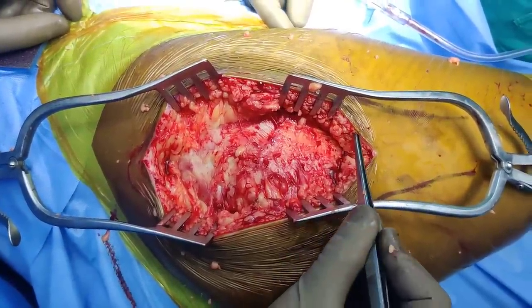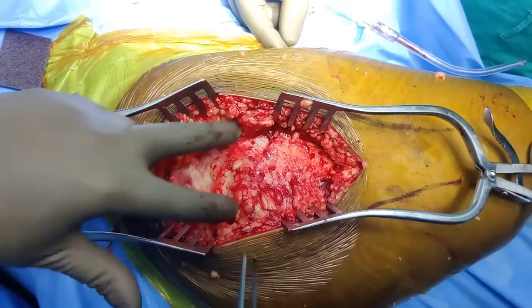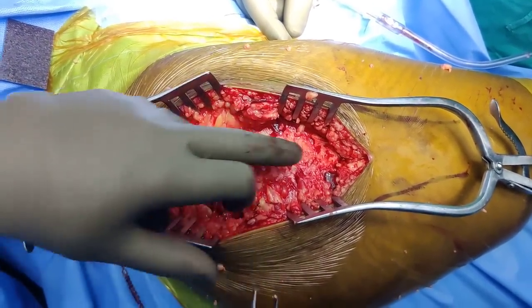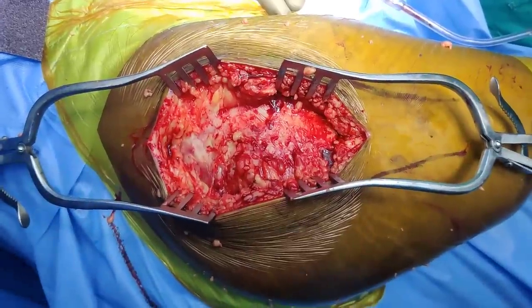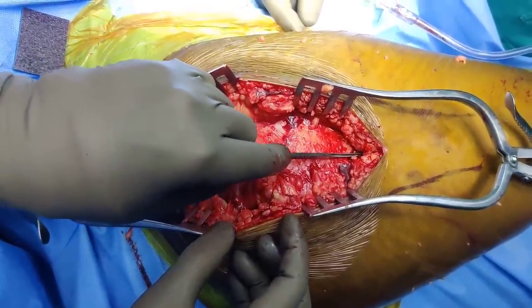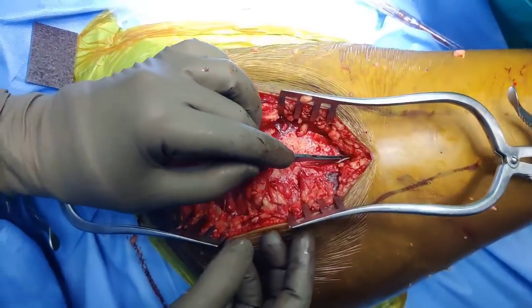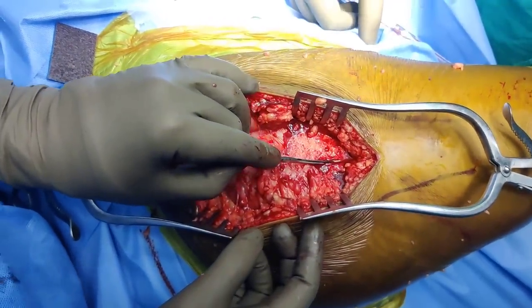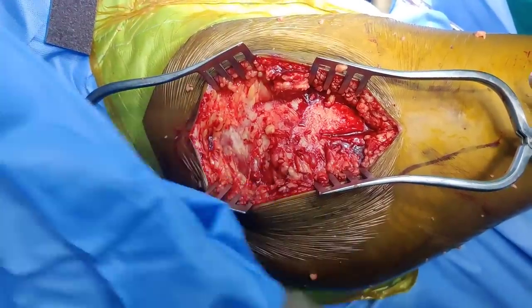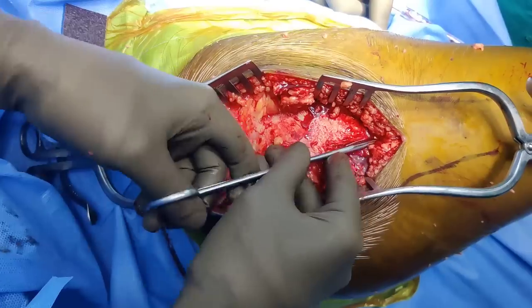Our superficial dissection is done — skin, subcutaneous tissue, and fat layer done. This is fascia lata, this is the front part, this is the back part, this is the tip. Now the next thing is to incise the fascia lata distally, and in this position you can ask your assistant to abduct the leg to take the tension off, and then just take a knife and dissect it.